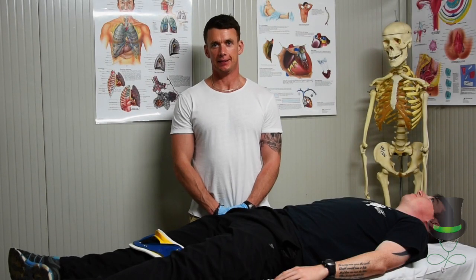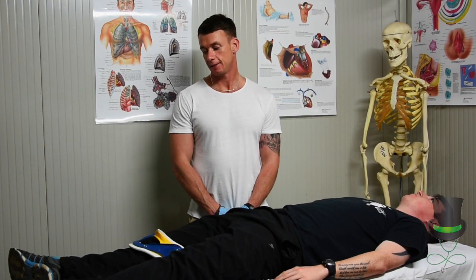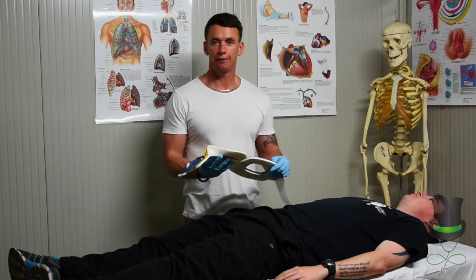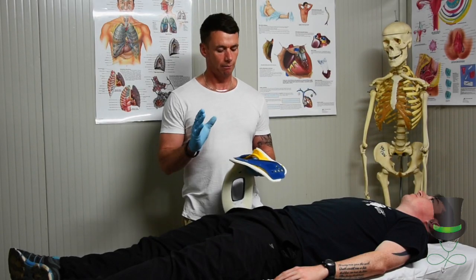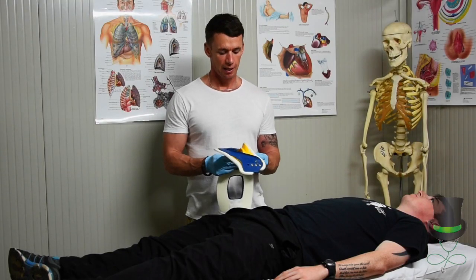Hi, I'm Anthony and I'm a paramedic. Today I'm going to demonstrate to you how to put on a stiff neck collar. This is the type of stiff neck collar we're going to use today. There are a lot of different collars out there, so become familiar with the type of collar that you're going to use in your local setting.